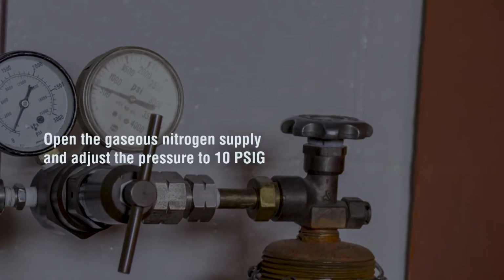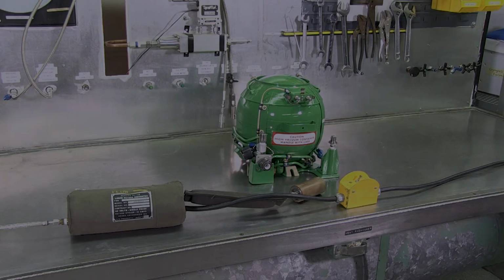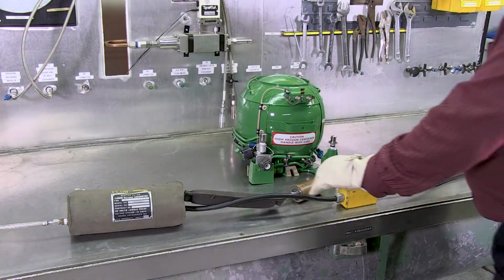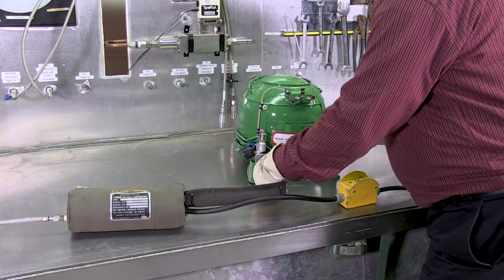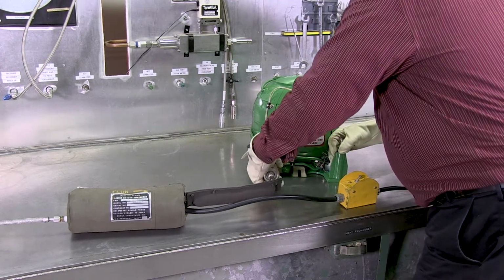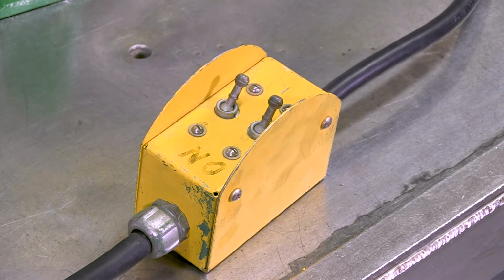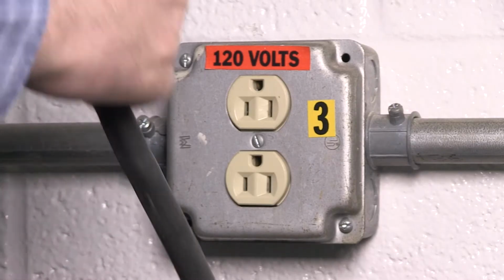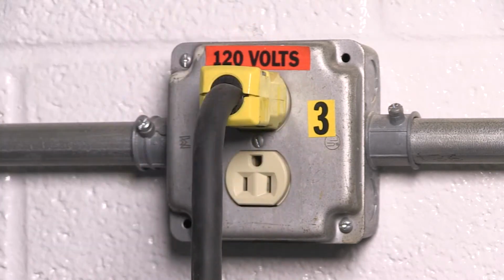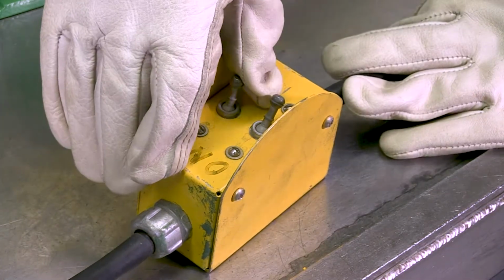Open the gaseous nitrogen supply and adjust the pressure to 10 PSIG. Allow the purging gas to flow for 1 minute. Using the female filler adapter provided with the purge kit, connect the outlet of the purge heater to the converter fill port. With the purge kit circuit breaker switches in the off position, plug the power cable from the purge heater into an electrical outlet providing a source of 120 volts AC. Place the circuit breaker switches in the on position.